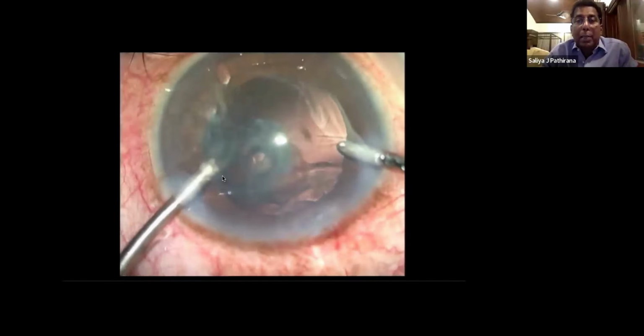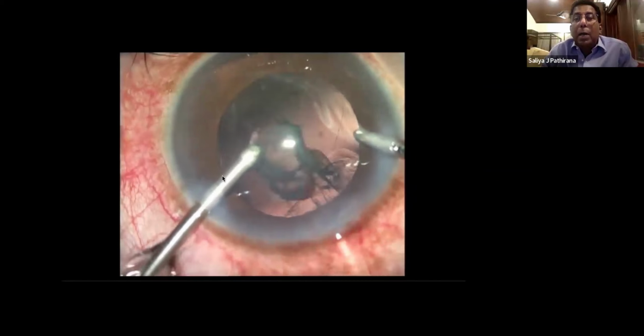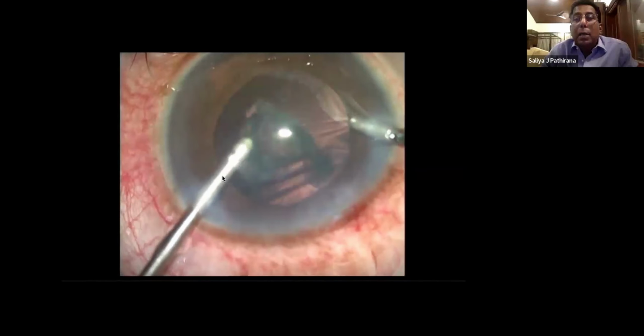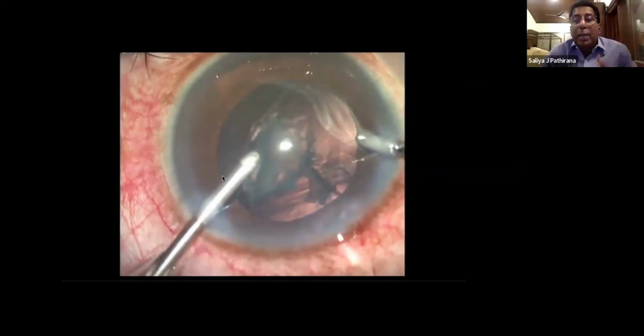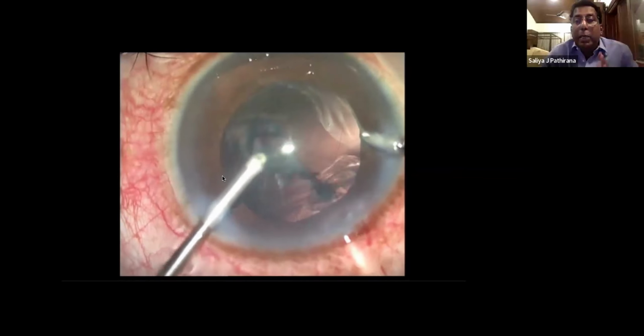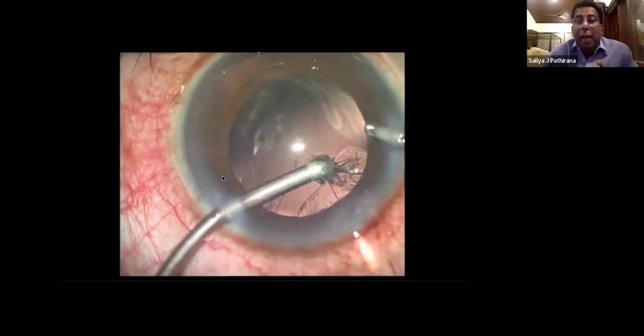Now I'm going to show you a video, which is one of my cases. Once I was doing this, I found that there was a 6 o'clock to 12 o'clock lens capsule rupture. So what I did, the number one rule, is don't pull the irrigation out. And in this case, the vitreous face is not disturbed, so I could easily remove the lens fragments. And then finally, with the left hand, I injected the OVD and covered the gap.